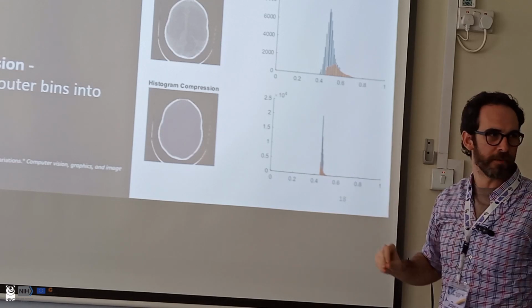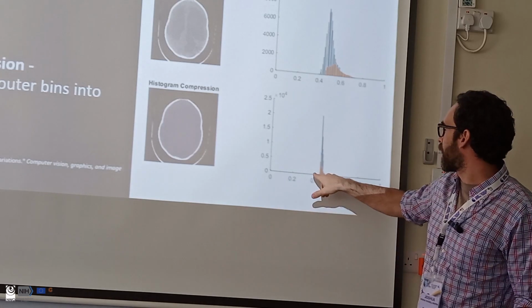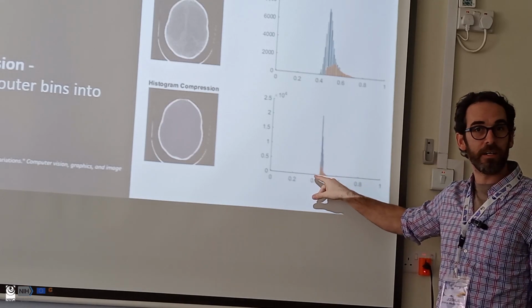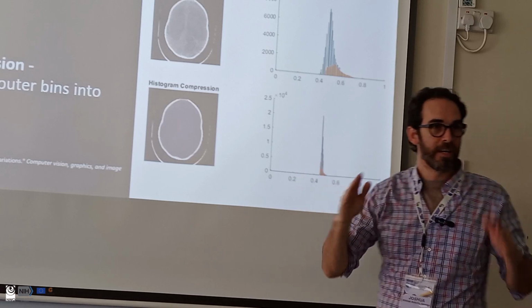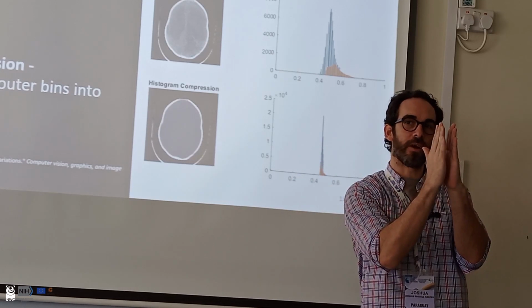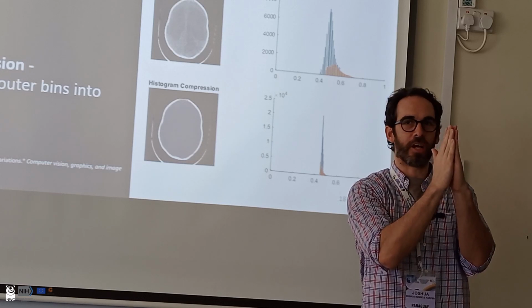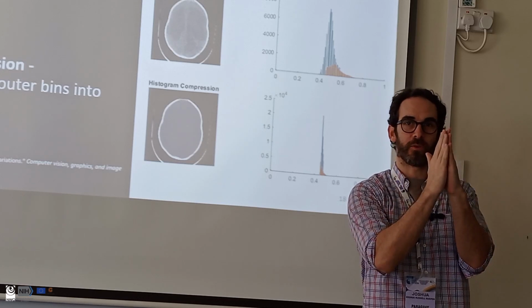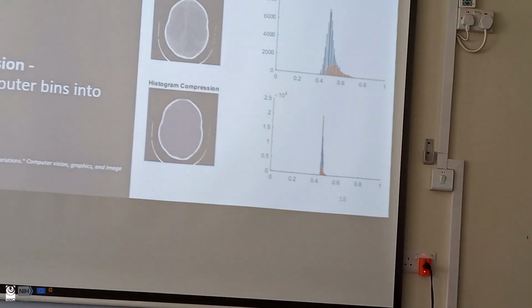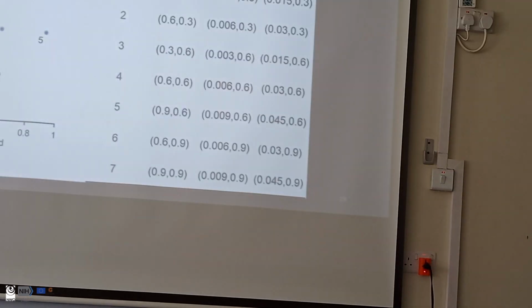So I can do this iteratively. And then I can calculate the median grayscale value of brain and the median grayscale value of CSF. As those two numbers get closer and closer together, I have this continuous range of contrast between the two that I can adjust. So I can define the contrast between those two on a continuous scale.